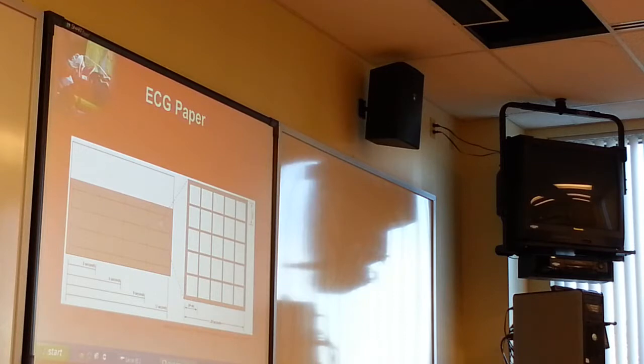Okay, so here's your EKG paper blown up. It has not changed. It only has gotten bigger. You know, LifePak 5s were really super small. The 10s got a little bit bigger, and the 12s and the 15s are the same. If anybody's ever seen a LifePak 5 or a LifePak 10, you know what I'm talking about. They're really, really small. But it's the same concept. It hasn't changed in 25, 30 years.